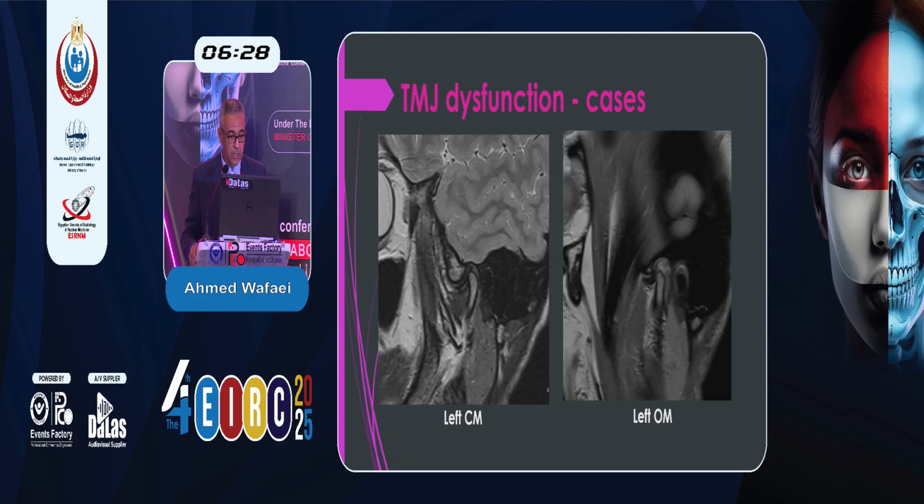This is a patient complaining of chronic left-sided pain of the temporomandibular joint with dysfunction and reduced range of motion. We can see here the disc is deformed, showing heterogeneous high signal intensity and displaced anteriorly, and it just moved a little in open mouth compared to the closed mouth. Also, there is distension of the posterior part of the joint with mild adhesions posteriorly. So this is a non-reducible anterior disc displacement with a somewhat stuck disc in an anterior position.